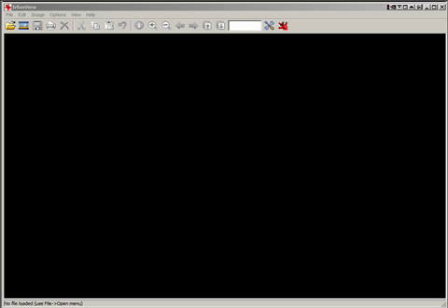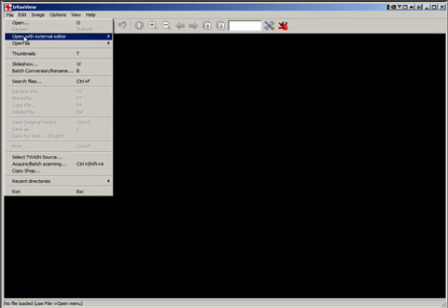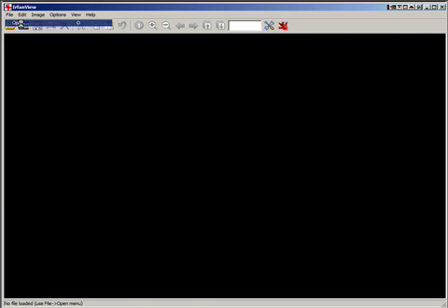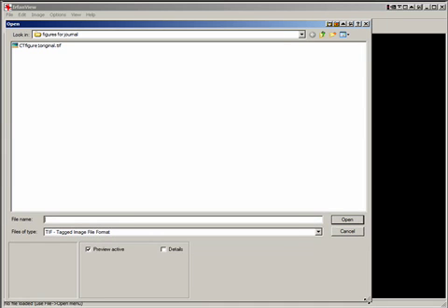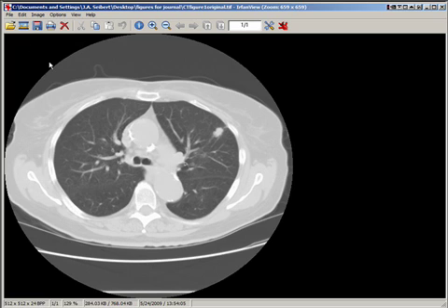IrfanView software is illustrated as one solution to subsequent modification of the resolution and size of the image. First, open the image file, selecting the original image. Now one can begin the manipulation.